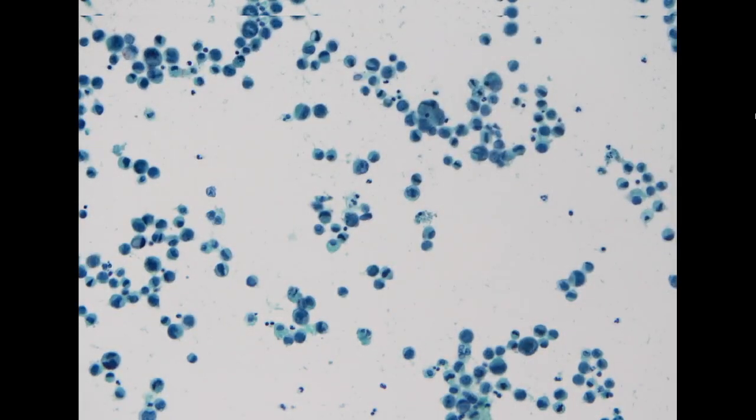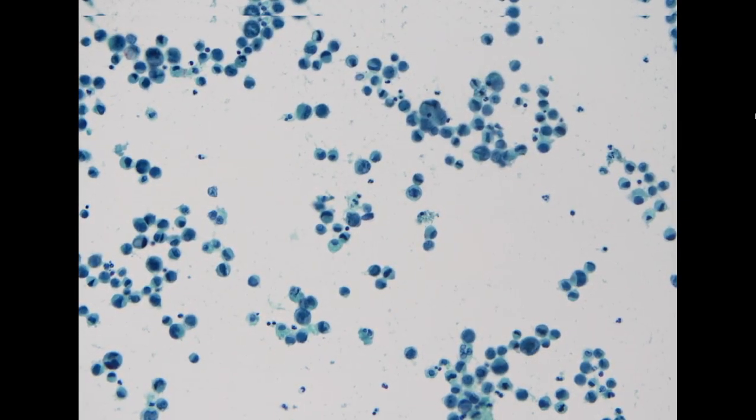So the next specimen is from an elderly female, 84 years old. This is a pleural effusion specimen, but she has a relatively different history. On low power, we see tons of cells and they look very big. Most of them are individual cells. The patient had a history of gastric cancer.